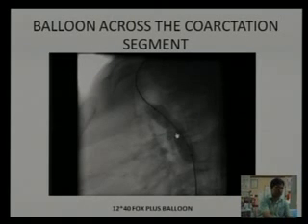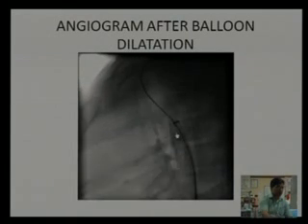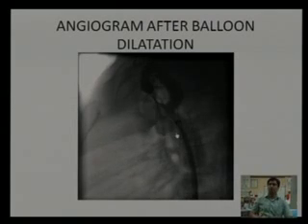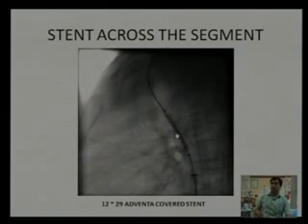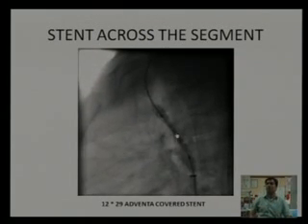So you can see the indentation. After the full balloon dilatation with the 8 atmospheric pressure, we see these results. After that, the pulses marginally improved, the graph of the femoral pulses improved. So we thought we will go with that because there is no such gradient coming in between the descending aorta. So probably it may be because of the coarctation at the upper coarctation level that is causing no gradient at the lower coarctation level.